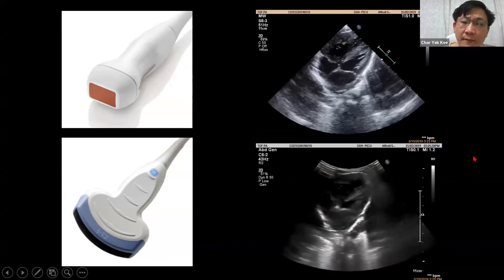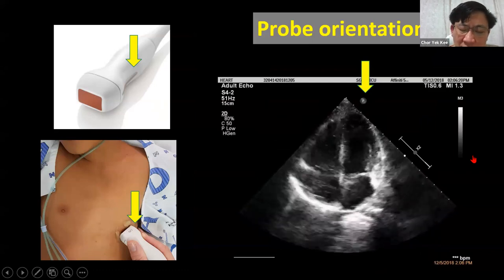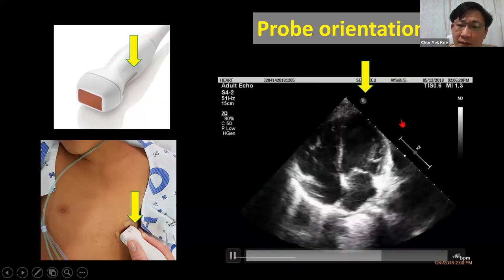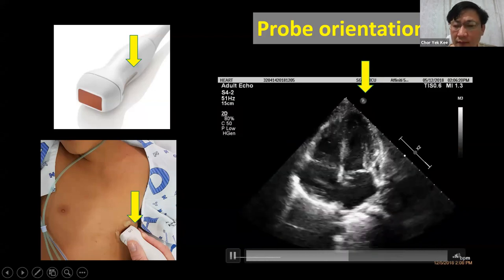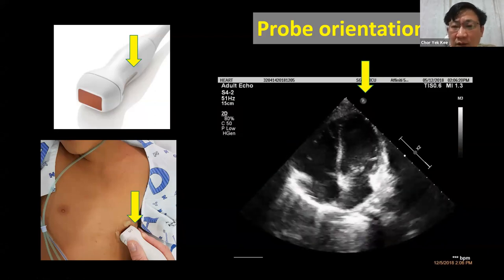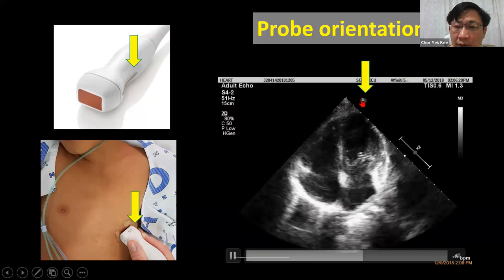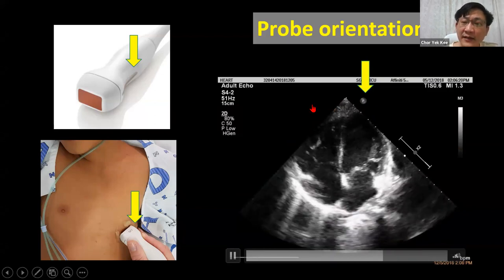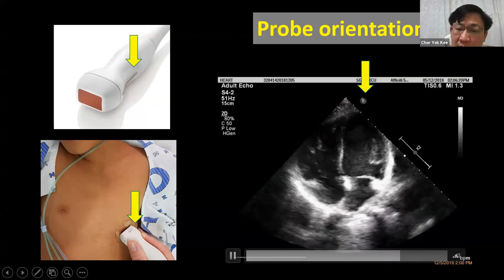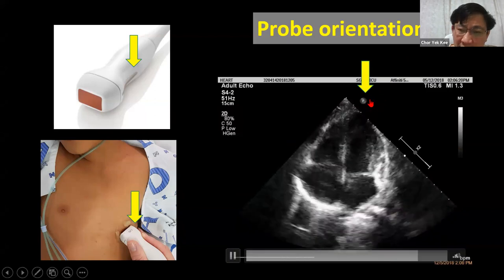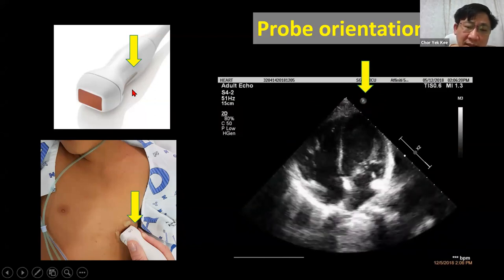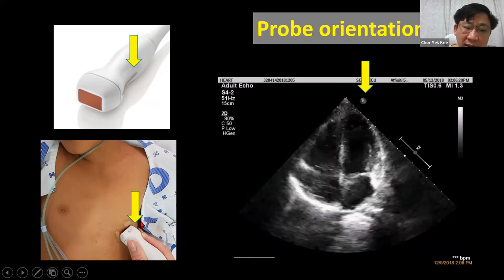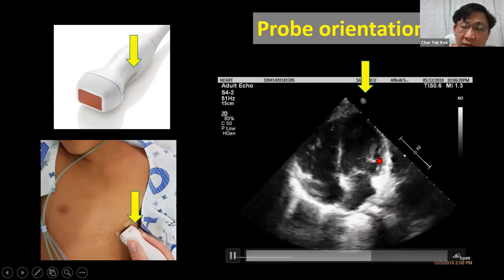There are some rules for ultrasound and echo. The cardiac echo marker convention is the reverse of usual ultrasound. For most ultrasound, the marker is always on your left side, or the patient's right side. But for echocardiogram, the pointer points towards your right side, which is the patient's left side. So when you put the probe on the patient, the pointer will point towards the patient's left side.